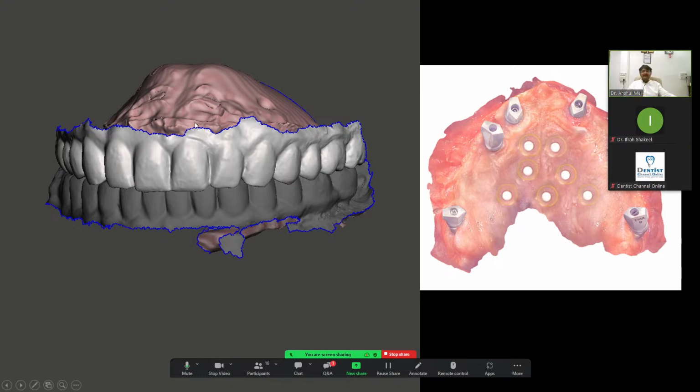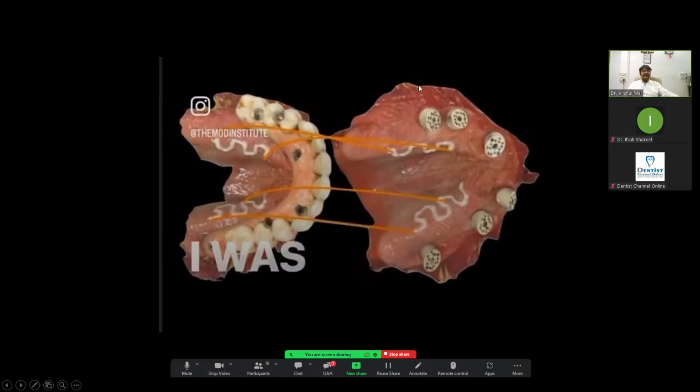As you can see, now there is a prosthetic and the marker inside of that. For the second scan you take out the prosthetic, place the scan body and scan it. So in both, the common part is my composite. So I can superimpose this scan with this occlusion and I can get the jaw relation. So this can have a scan body and this can have a prosthetic, and I can superimpose onto it. So I will get the jaw relation and the scan body, which means the implant position. So I have the midline, occlusal plane, everything I got, so I can directly start fabricating my prosthetic.